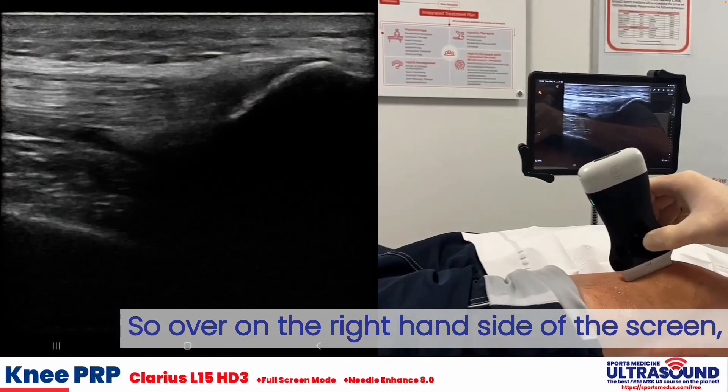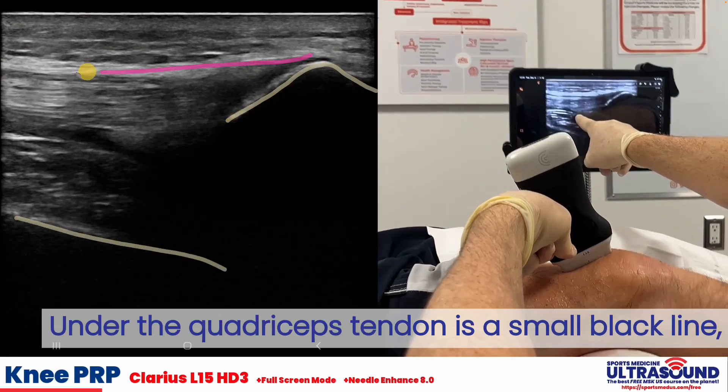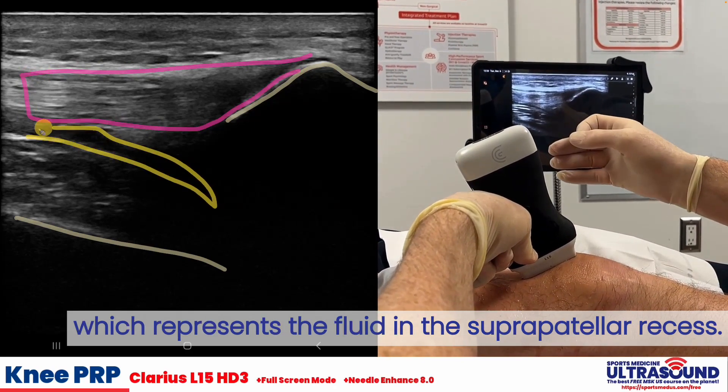Over on the right-hand side of the screen, we've got our patella. Down on the bottom left-hand side, we've got our femur. Under the quadriceps tendon is a small black line, which represents the fluid in the suprapatellar recess.